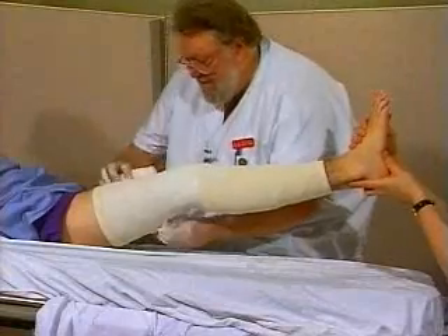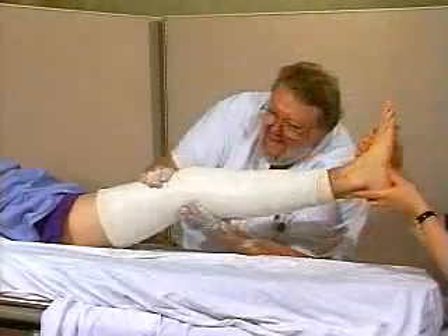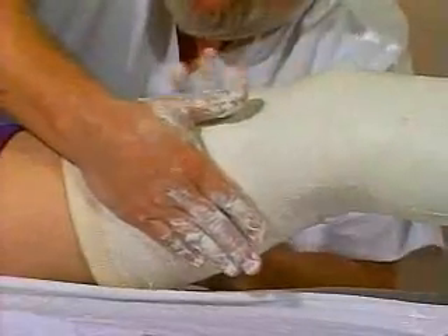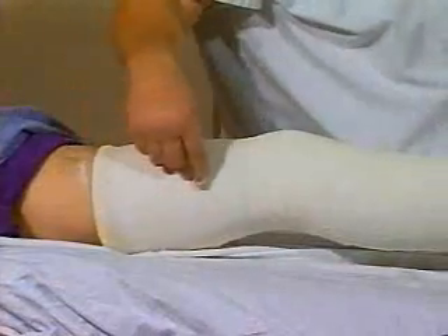A third layer may be started proximally and worked distally. Smooth the layers. Mold at the thigh with lateral pressure. Check that the upper and lower landmarks are okay, and the knee is at 5 degrees of flexion.